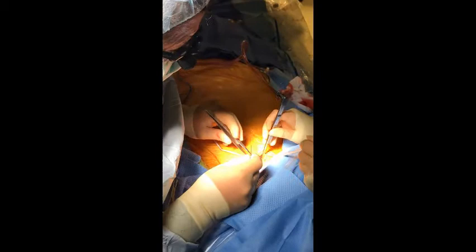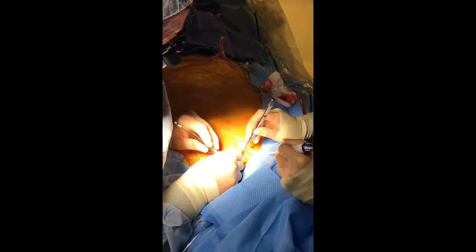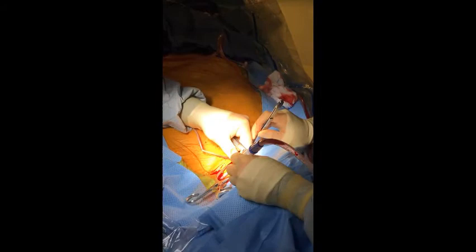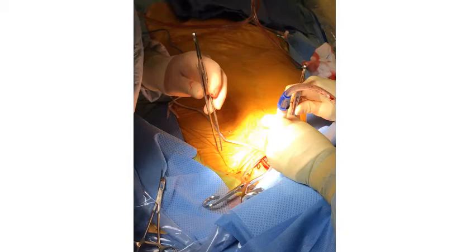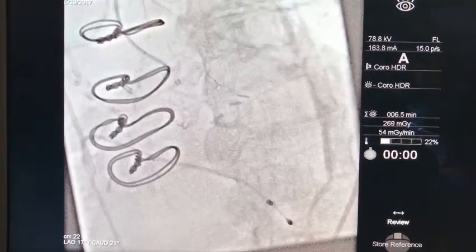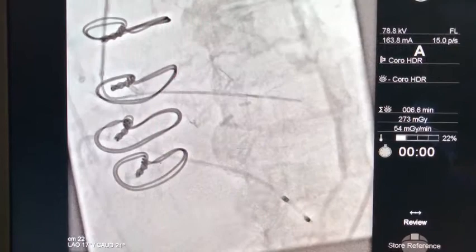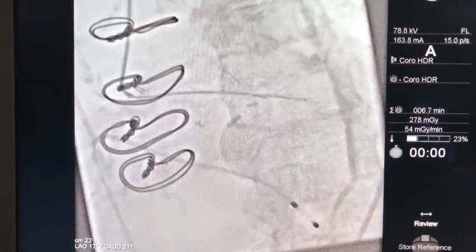We access the carotid artery using a Seldinger technique, taking care not to puncture the back wall of the artery. An 0.035 wire is then inserted under fluoroscopy, followed by a 6 French sheath. The native or prosthetic valve — in this case — is crossed using either a JR4 or, in this case, an AL1 catheter and a Medtronic straight wire.